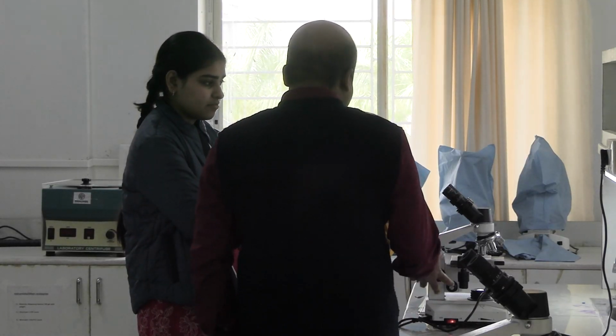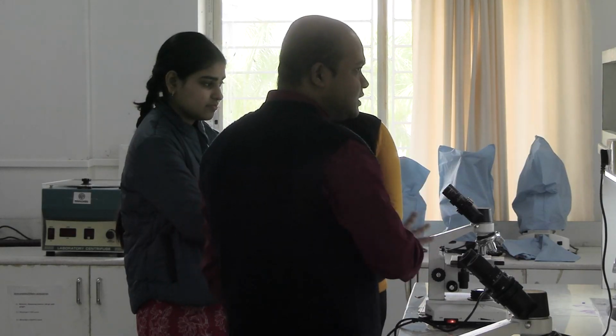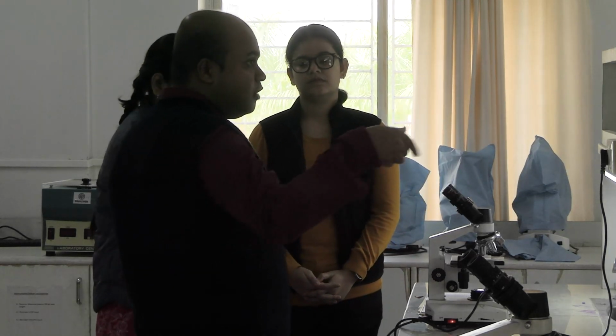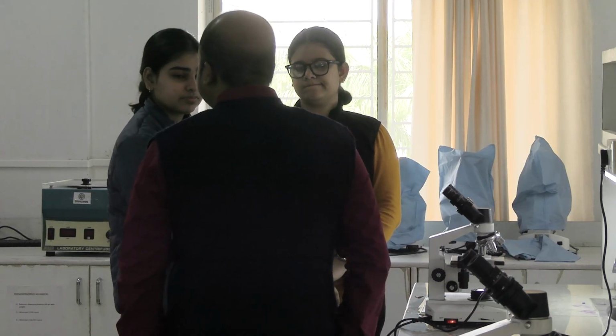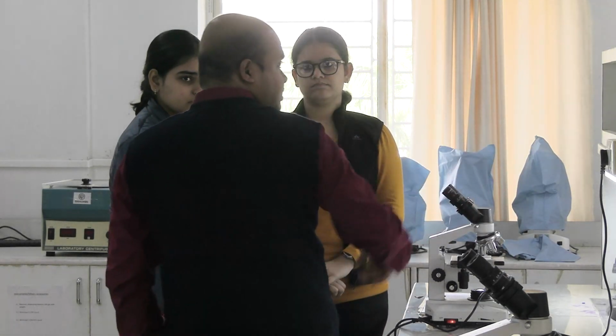So there has been some mistake in the whole process because of faulty technique. If it were the fluid, it would be in every microscope, but the fluid has been supplied from the same container, so there is no problem with the fluid. The problem is faulty technique. In 2 or 3 microscopes I am seeing that this has come like this.